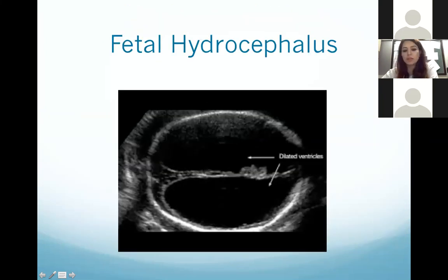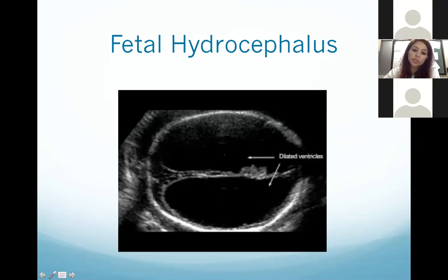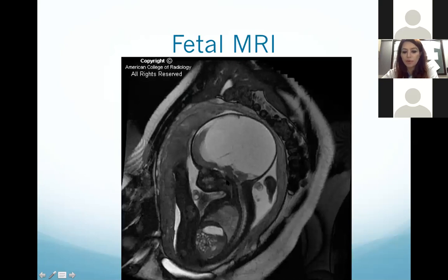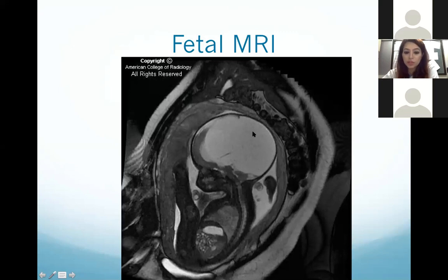This is an image of the fetal brain showing the entire cranium. The two large black areas are fluid accumulated in both ventricles — this is a case of fetal hydrocephalus with dilated lateral ventricles containing CSF. On fetal MRI you can see the entire fetus — the face is disproportionately small compared to the extensively enlarged head filled with fluid. This confirms enlarged lateral ventricles due to hydrocephalus.